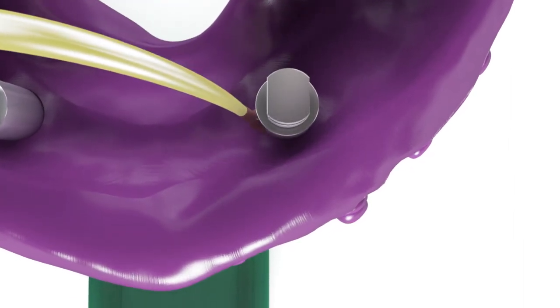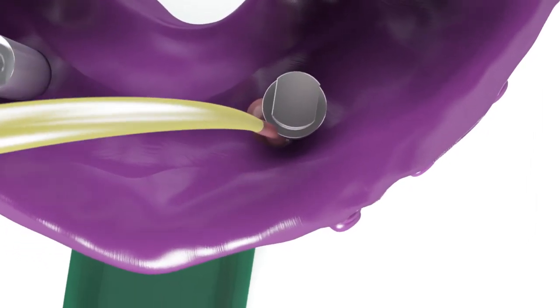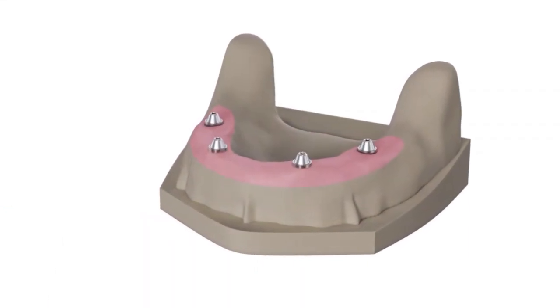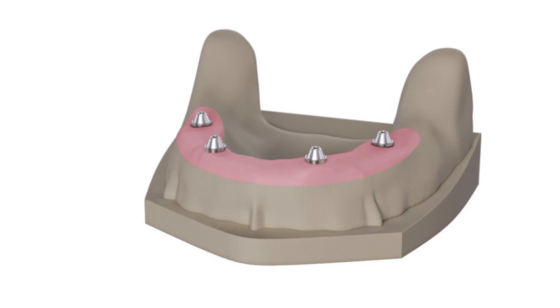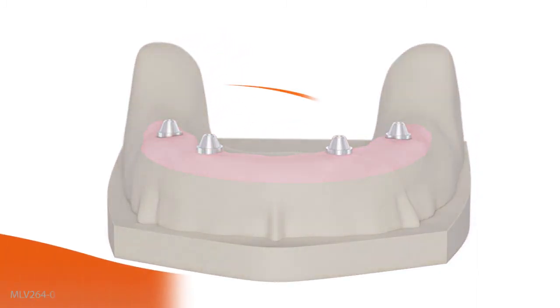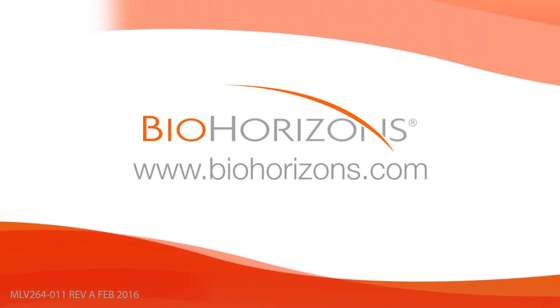Syringe soft tissue material around the multi-unit replicas. Fabricate a working model using minimal expansion, high hardness, die stone. Articulate the model according to normal laboratory procedures.